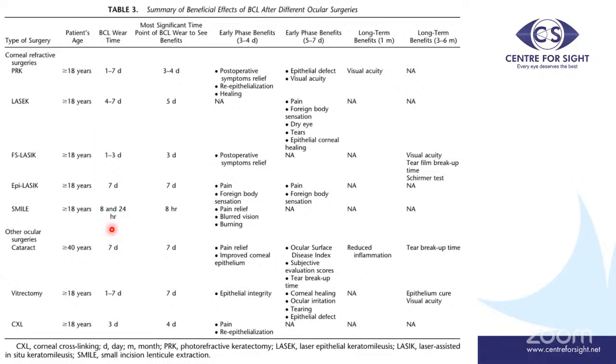BCLs can be worn from 8 to 24 hours, and even within the first 8 hours, there is reduction in pain, improvement in blurred vision, and burning sensation for the patient. For other ocular surgeries like cataract, vitrectomy, and even corneal cross-linking, in cataract, studies have found reduction in pain even within the first 7 days, improved corneal epithelium.